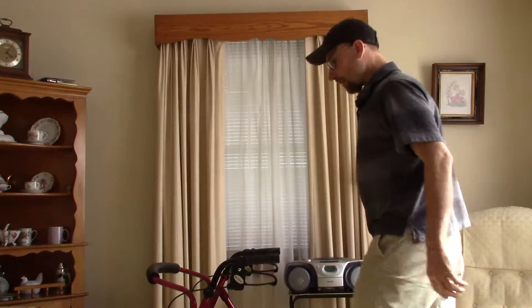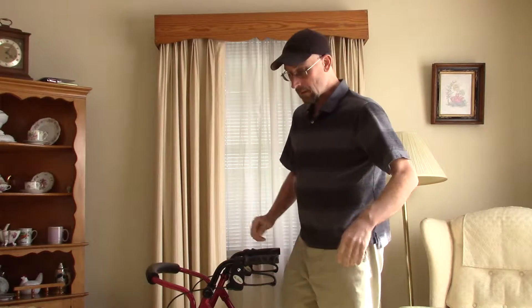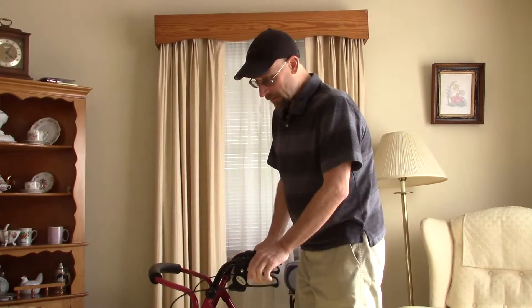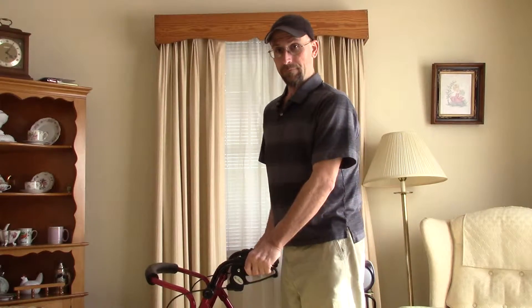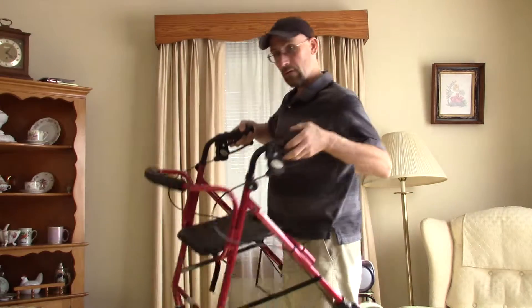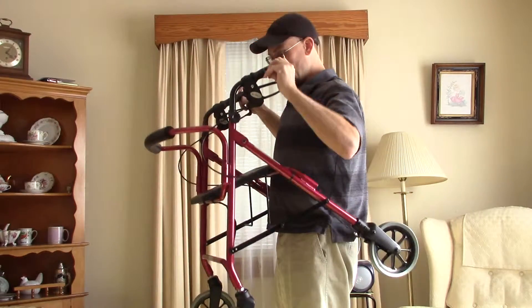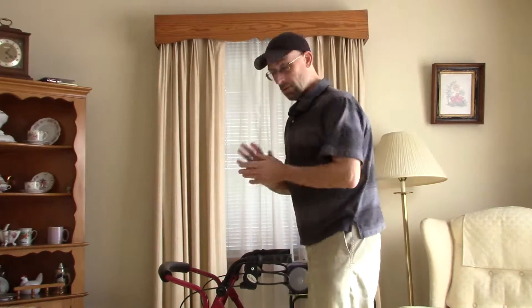Hi, it's Frank here with OxygenGuy.com. I'm here to talk to you about how to use your four-wheel lightweight rollator, or four-wheel lightweight walker. This nice model here has brakes — I like bicycle brakes — also a seat and four wheels.